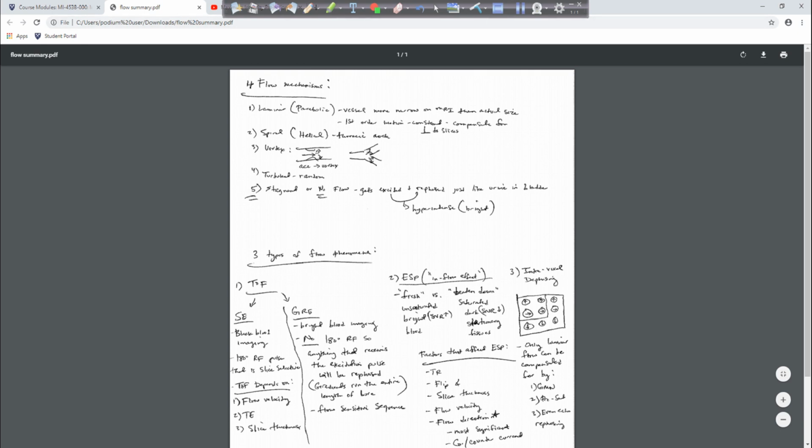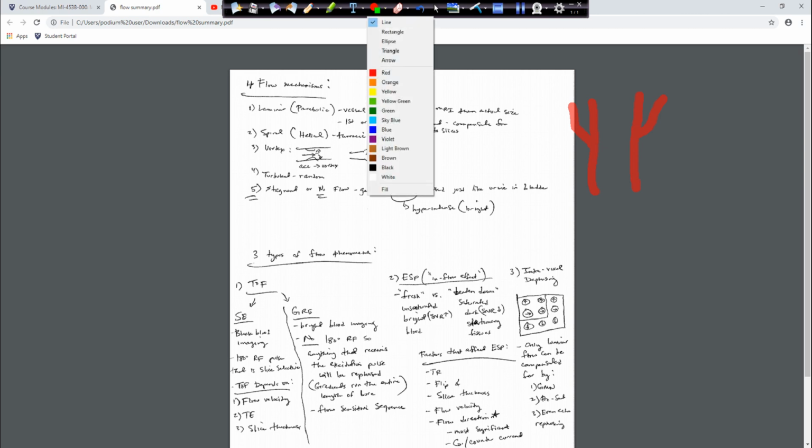So imagine we had our carotid arteries when we say perpendicular to the slices. We have our right carotid artery, internal, external, and we have our left carotid artery, internal, external. When we're talking about perpendicular to the slices, our slices are usually set up like this.